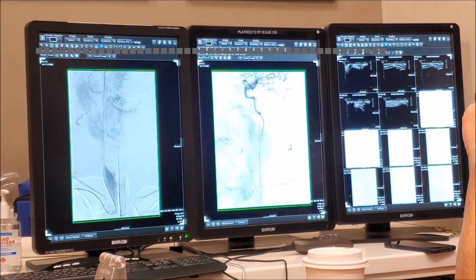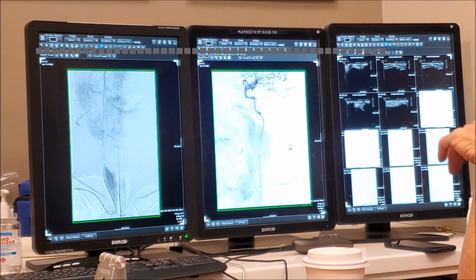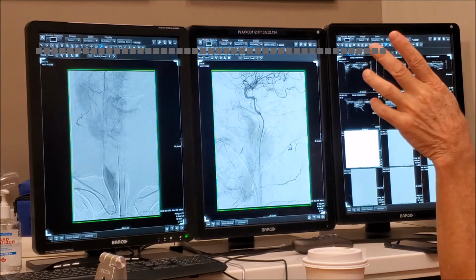Now the next question is: did something happen here? This was a smaller artery, but did something happen? No symptom, right? Well, the patient is developmentally normal. They didn't get an acute stroke or ptosis of an eye, a Horner syndrome, right? Correct.